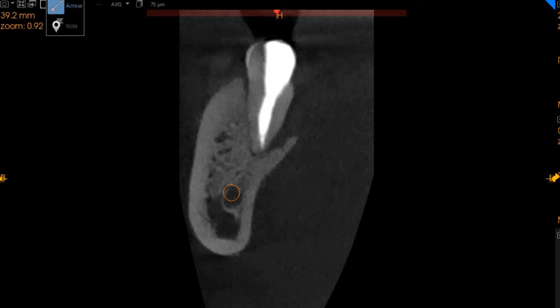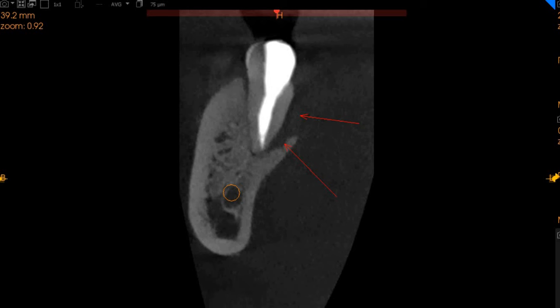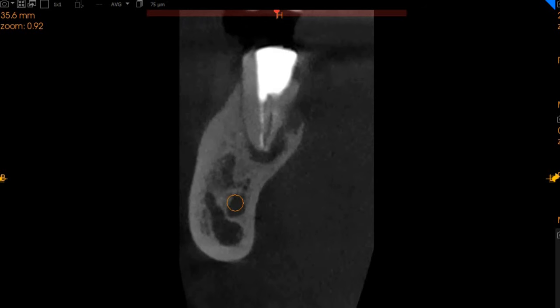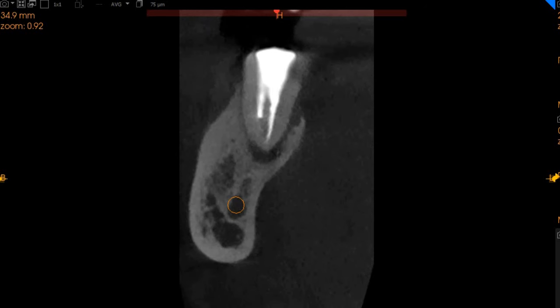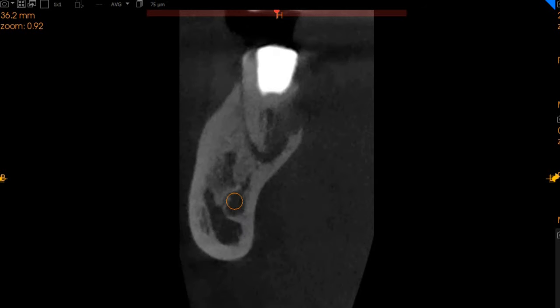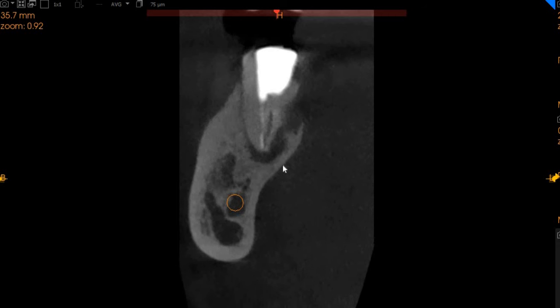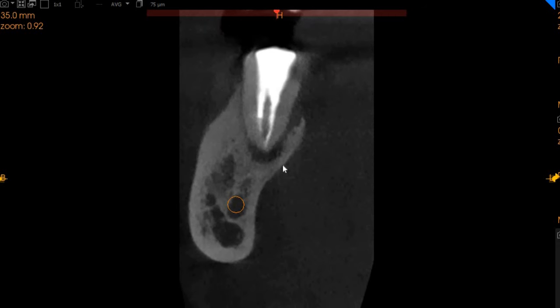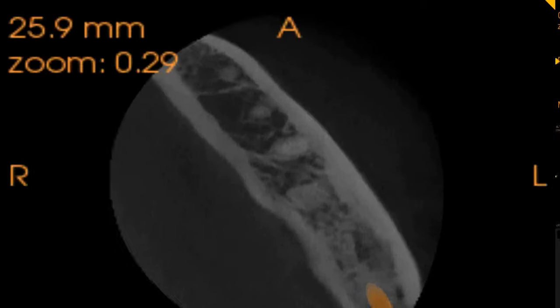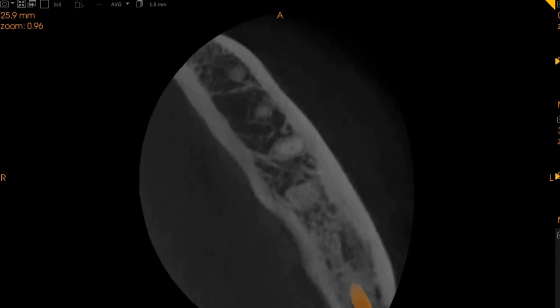As you can very clearly see, we've got an immense periapical radiolucency on the lingual aspect, and significant bone loss. This is the distal root, this is the interradicular area, and this is the mesial root. Here you can very clearly see the mesial root is obtured, but we've got a significant fracture on the lingual aspect.